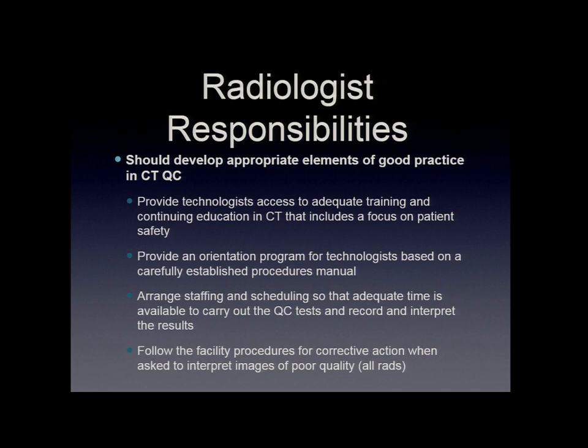Because I've been into some places and they have their QC recorded, and I'll look at it and I see that they failed. I said, did you notice that you were out of spec? They said, yeah, but it was okay, and we just kept moving on. And it's like, no, you really need to address this. Take a look at it. Is it clinically relevant? Talk to the radiologist that's going to be reviewing this. You need to make sure that if there is a QC parameter that's outside of the control limits, there is corrective action that's applicable to the parameter you're looking at. And it really needs to be a discussion with the radiologist.